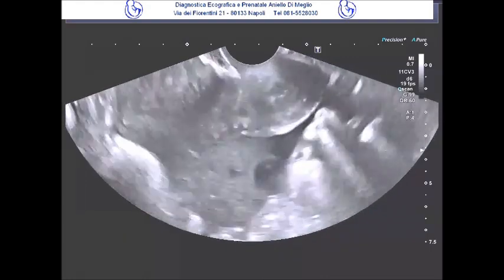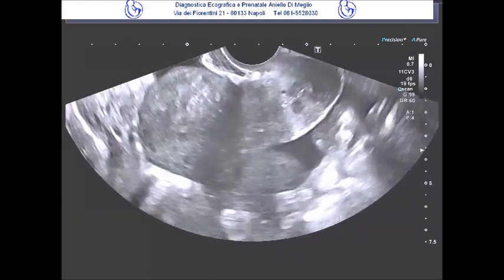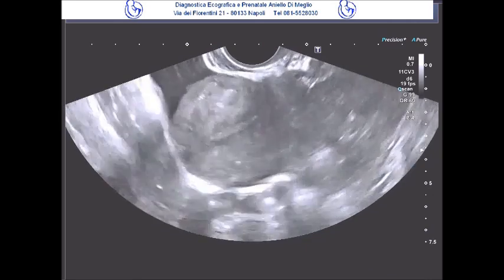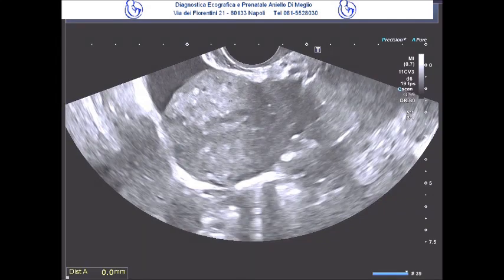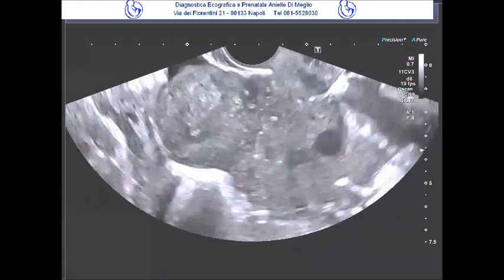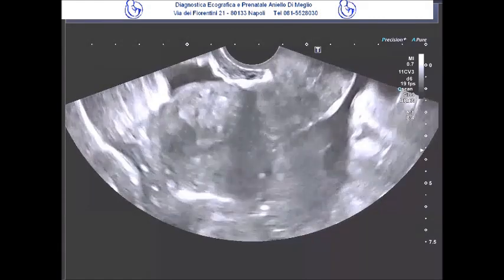And in the next images, you'll see how in a single image, you can actually see the uterus in the center with the 2 ovarian masses, which, let's say, move from their normal position more towards the Douglas pouch, and so they look quite similar to each other. Here you can still see at the top the small fluid collection I mentioned earlier, along with the small fluid collection in the Douglas pouch.